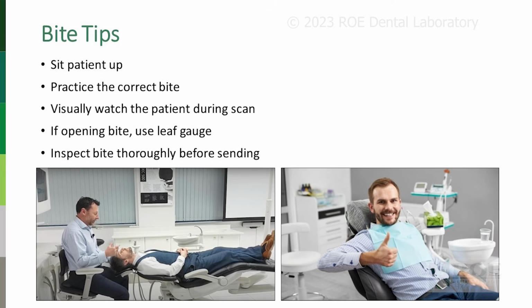or some method that allows you to get the patient in a centric relation bite if you're opening them a lot on the day of surgery. We're not doing some type of diagnostics for a few appointments. Open the bite up and then just inspect it thoroughly before sending.